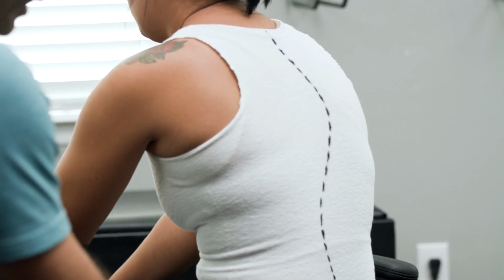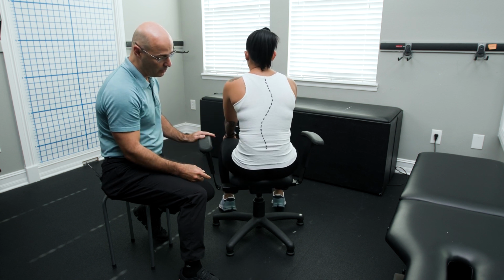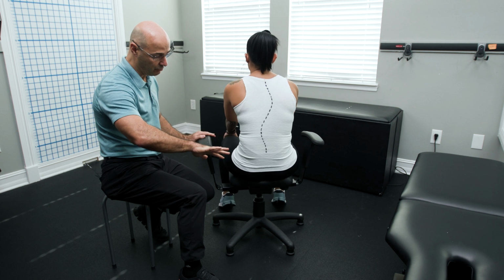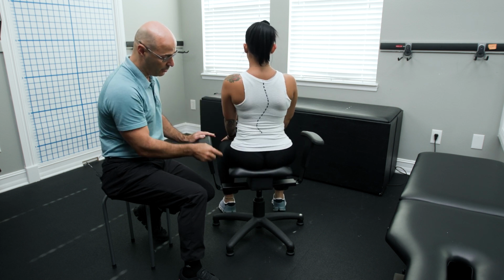And what you can see, the chair is actually moving under her pelvis. Go a little bit quicker there. So you can see how she gets full motion into these discs. And what they're doing is helping rehydrate the discs in this specific area. And she's rolling through her entire spine.